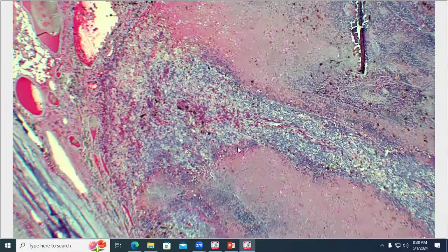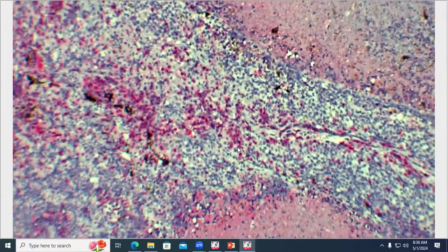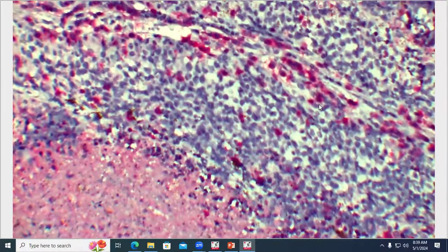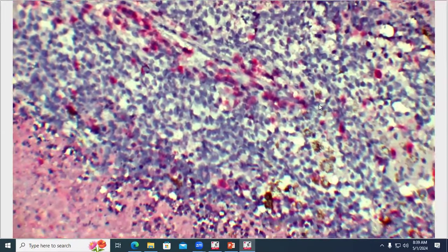We do have a red option for our CD3, which is nice when we're staining tumors that are in the anterior uvea, because it's a little bit less messy with all the melanin pigment. And if we look at the neoplastic population of cells, what we see with our CD3 red staining is that we do have some staining in here, but it's scattered around the larger non-staining cells. So this is more indicative of non-neoplastic T lymphocytes in here with the tumor, and perivascular as well. And then our CD79A, which we do not have a red option for, maybe yet. It might be something that our histology lab is working on. So it's going to go more brown.